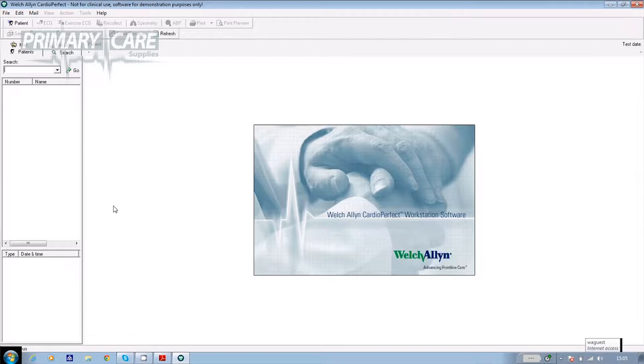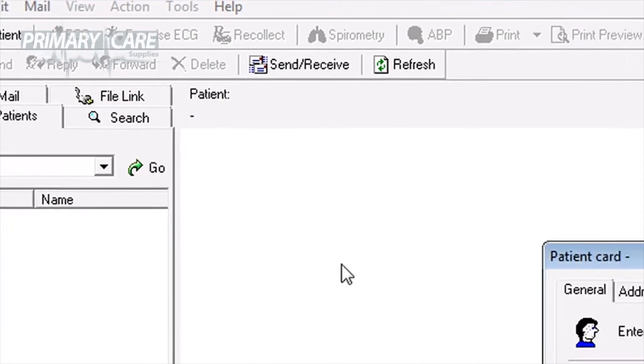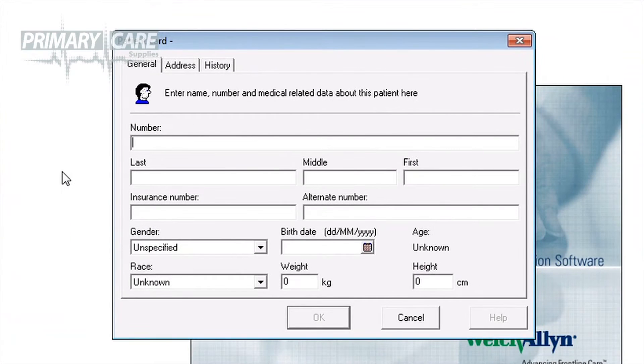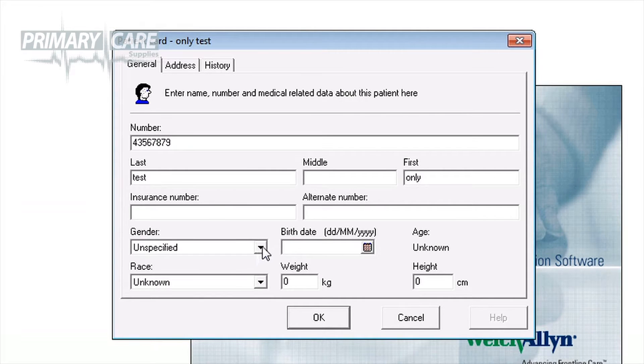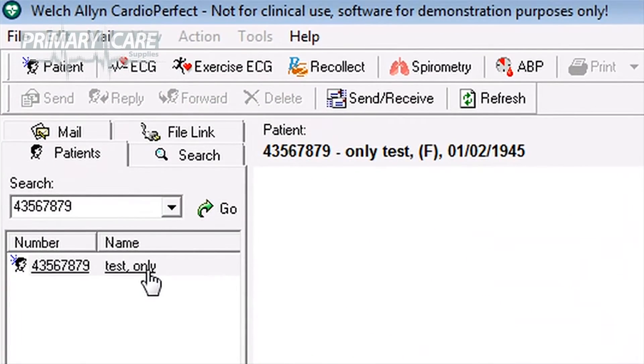Open the CardioPerfect software. If the patient hasn't had a 24-hour test on our system before, click on Patient in the top left-hand corner. Fill in their NHS number or other ID number, their name, and if you want to, the gender and date of birth. Click OK and the patient's details are saved.